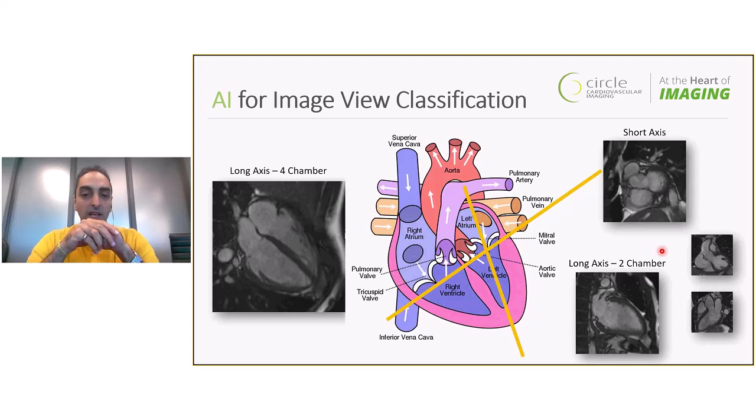However, this relies heavily on the technician to add that information correctly. And it's also dependent on the vendors, the name changes, it's all encoded inside this particular tag called sequence info. And depending on the regional language, or whether or not the technician remembers to do this, this particular header information is not always reliable, right?